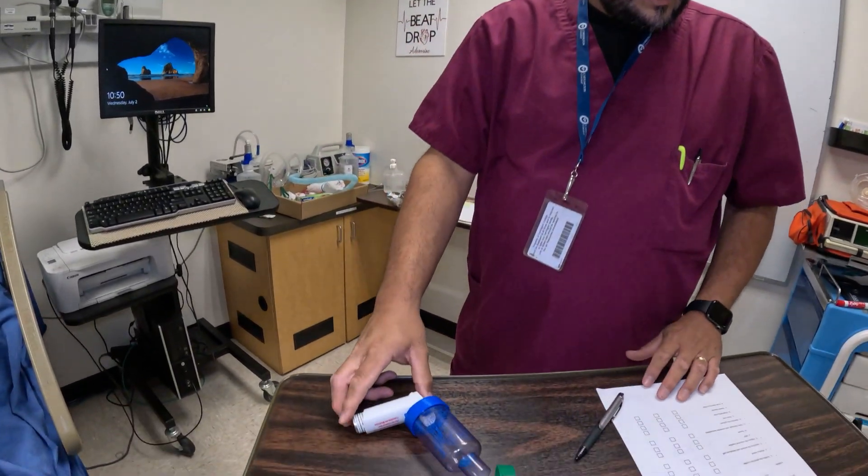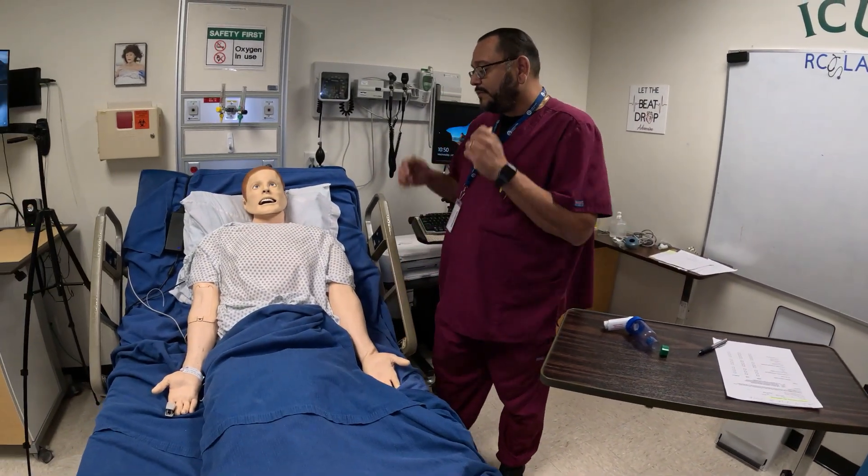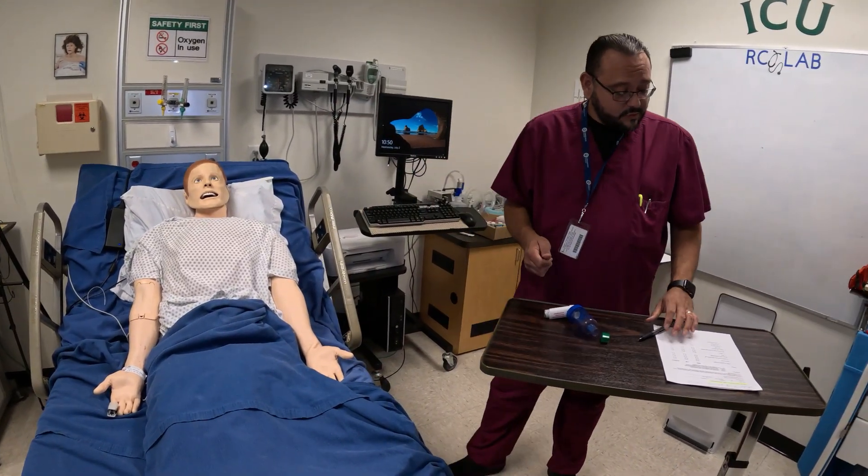We're going to go ahead and get a set of vitals. We definitely want to check heart rate and respirations. I'm going to take my stethoscope out and listen, and you also want SPO2 as well.